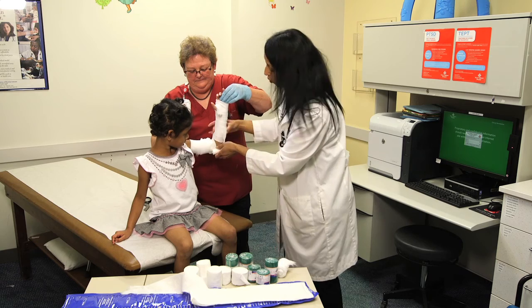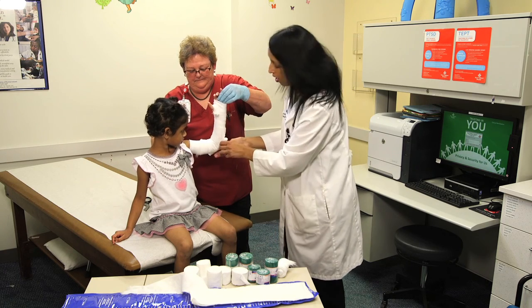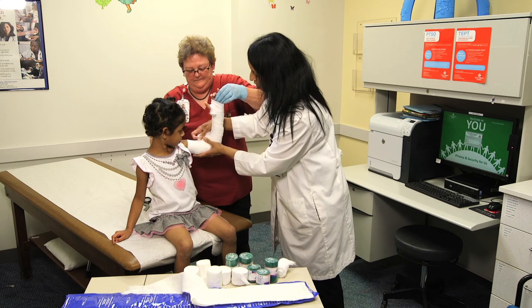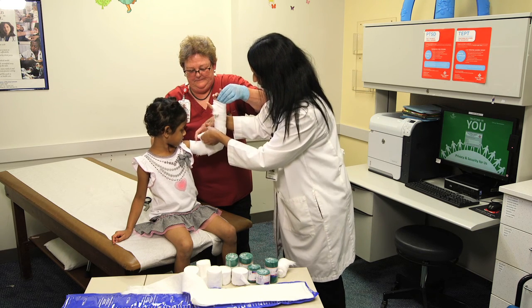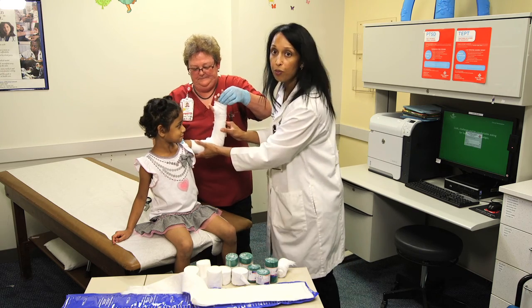With upper extremity injuries, you want the elbow flexed to as close to 90 degrees as possible, but keep in mind that you want the patient to be comfortable as well. This splint will typically last up to a week if necessary, but for any significant injury you typically want to see an orthopedic physician within three or four days, if not sooner. Once you have adequate padding and no bony prominences, then you get your splinting material wet.